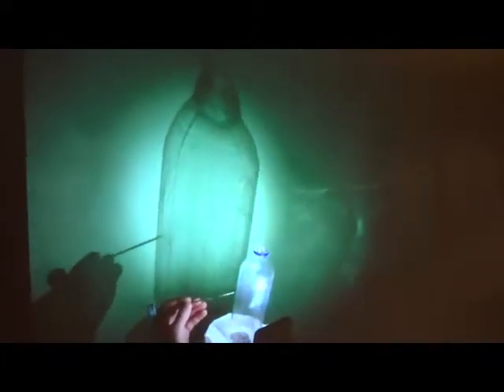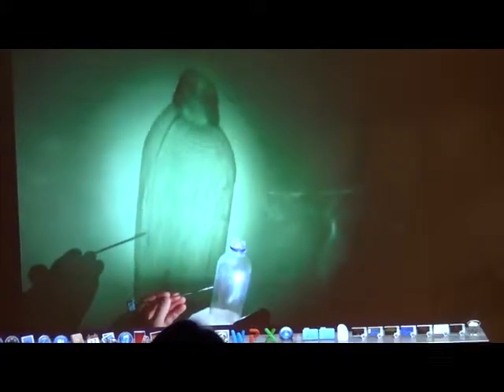With one needle approaching the ventral space from one side and the light source rotated towards the middle, I get a shadow on the opposite side of the wall. In fluoroscopy, the X-ray tube moves towards the needle and the image intensifier away from the needle. We call it the contralateral oblique view. If the light source is rotated to the opposite side, I get a shadow on the side of the needle placement. In fluoroscopy, the X-ray tube is away from the needle and the image intensifier on the side of the needle. We call it the ipsilateral oblique view.